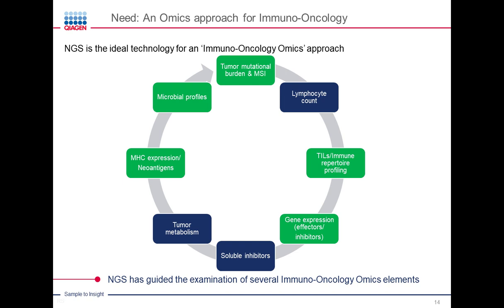And we know that NGS is the ideal technology for an immuno-oncology omics approach, because you could use the same technology to look at a lot of these elements.